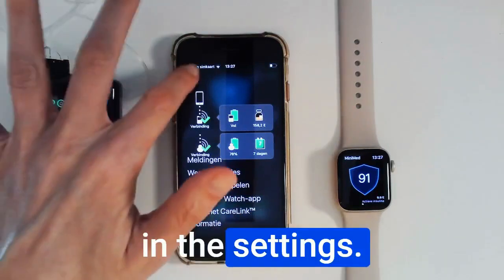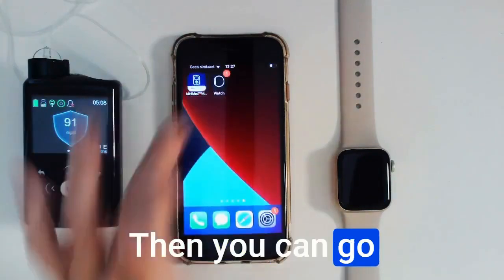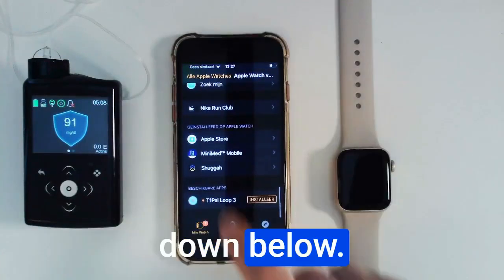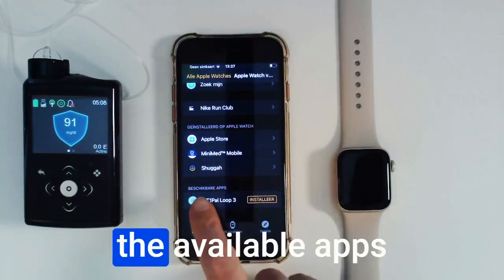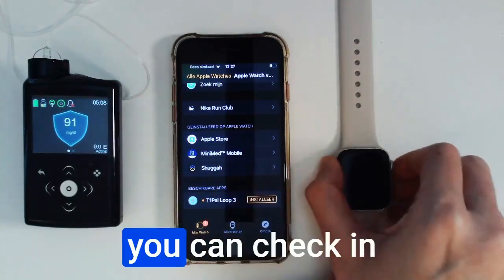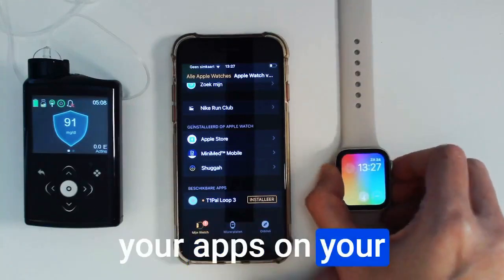Then you can go to your Watch app on your iPhone and scroll down below. Normally the MiniMed Mobile app will be here in the available apps, and you will be able to click on install. Once you do that, you can check in your apps on your phone that the MiniMed Mobile app is available.